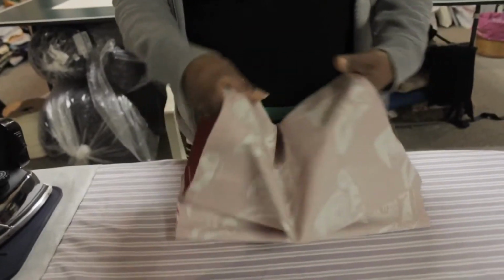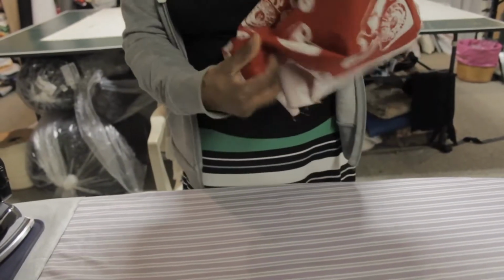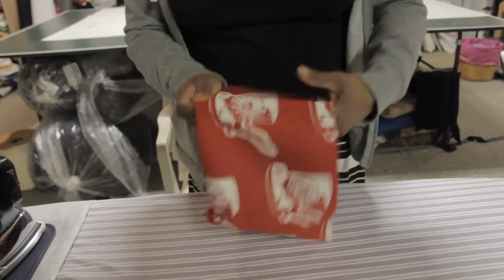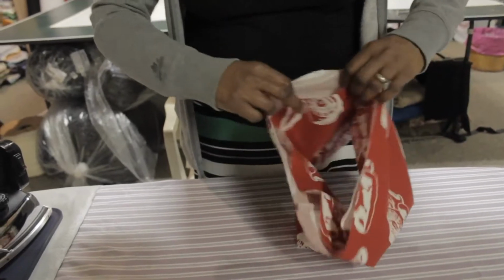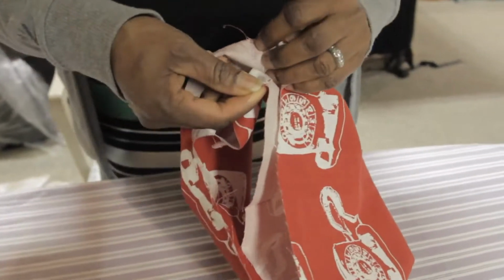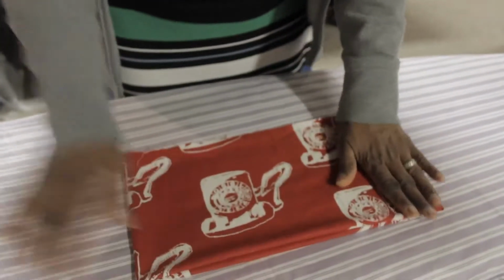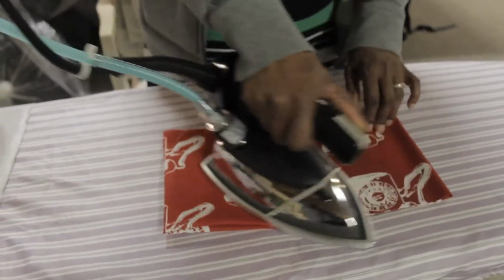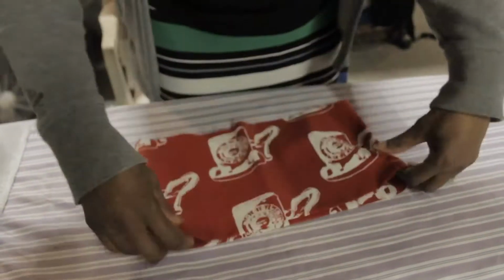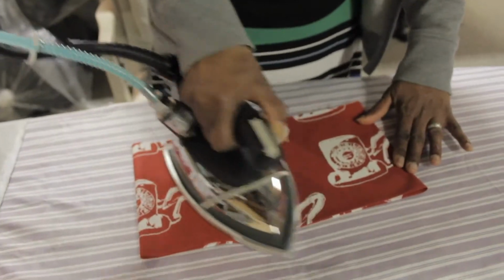And now we're going to fold wrong sides together. We're going to fold the whole thing wrong sides together, and we're going to match these seams up so that they are together. First of all, we start by matching our seam that we just made. We're going to hold that together, and then just take the whole thing and press it flat. And just so that we don't have a crease, fold it again and press.